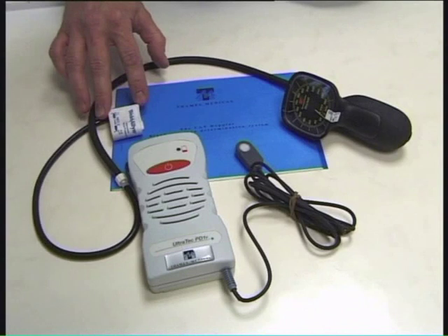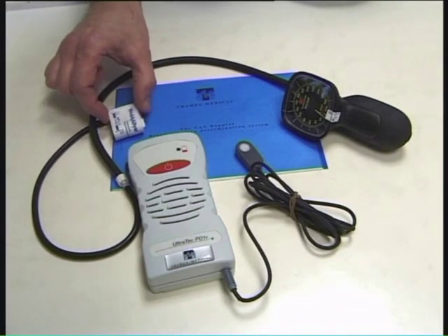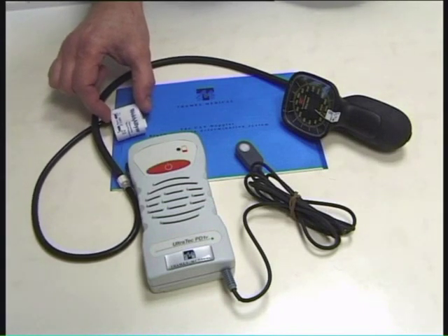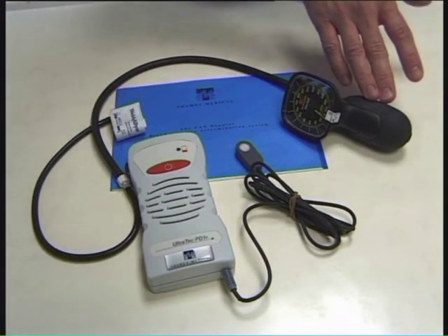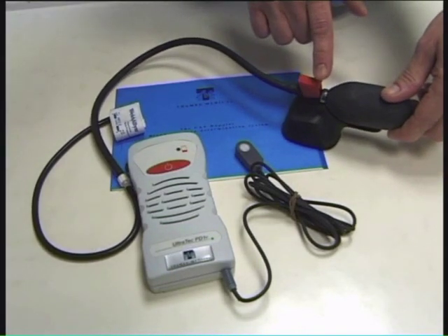This is the cuff that's placed around the limb. The width of the inflatable part of the cuff should be around 30 to 40 percent of the circumference of the limb that it's being placed around. And this is the sphygmomanometer used to inflate the cuff, and there is a slow-release valve on the back here.